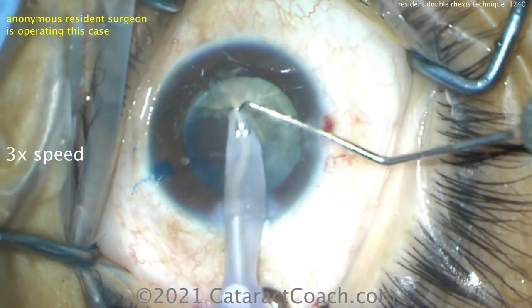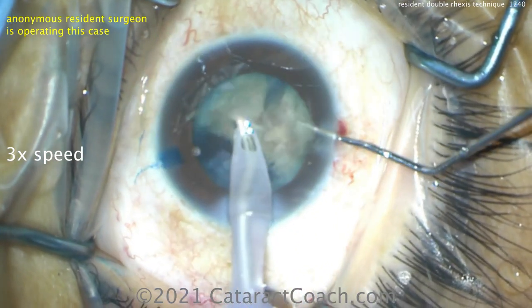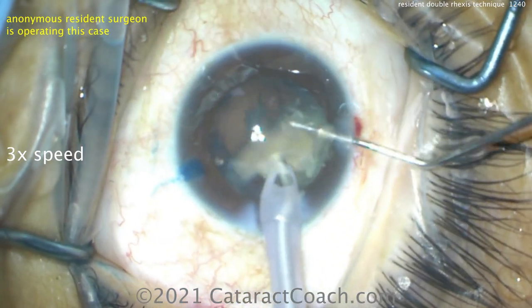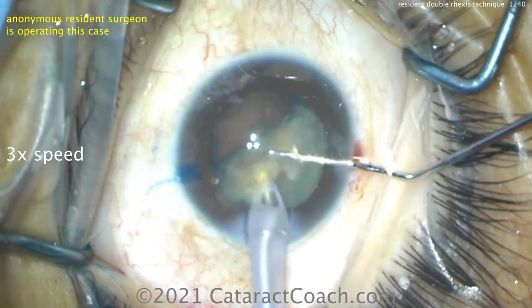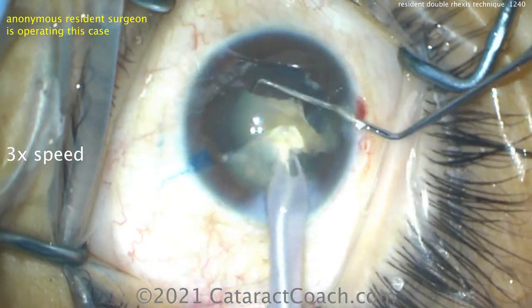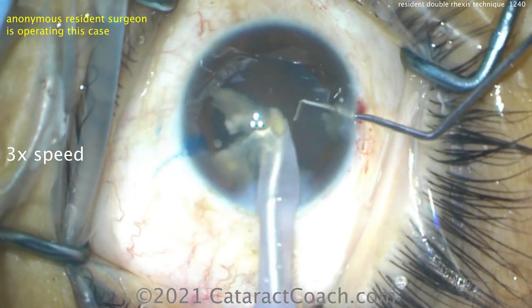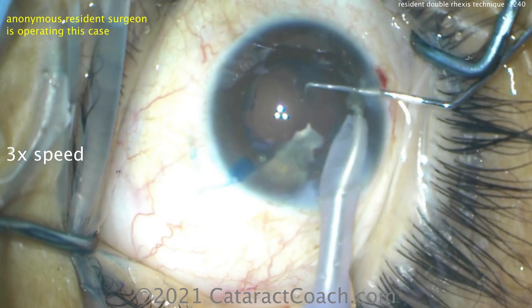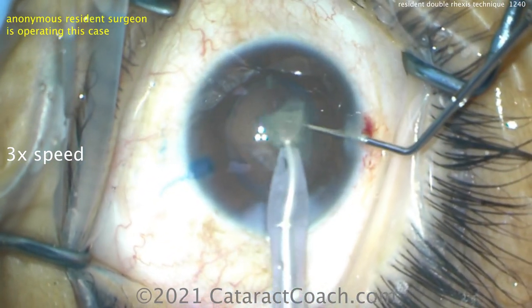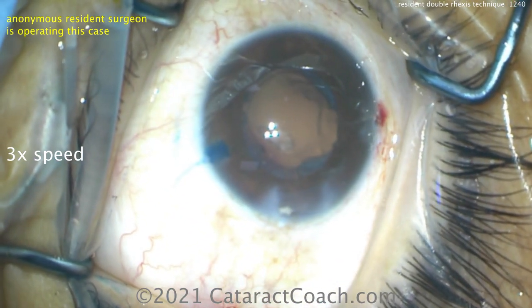So buzz in with the phaco probe, bring that piece up, and let's get around the equator and buzz into it. Remember, on the phaco chop, you want to chop at the highest vacuum. So when you start buzzing into the piece and you hear the vacuum go up, you want to chop at the peak of the vacuum — that's the most holding power. When you occlude on the piece, chop. But if you hear the vacuum pitch already starting to drop, don't chop there because you don't have the holding power.